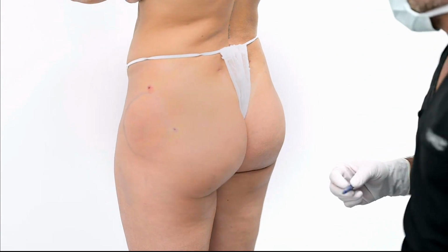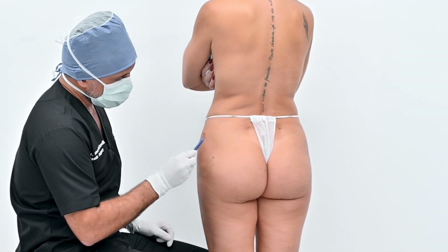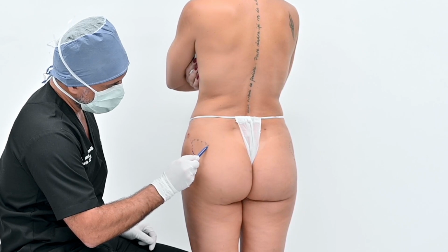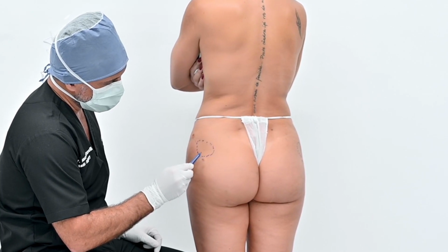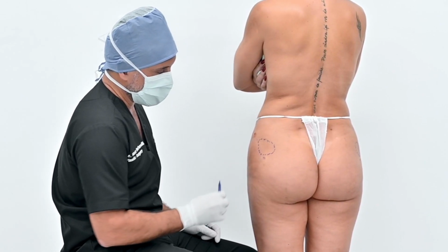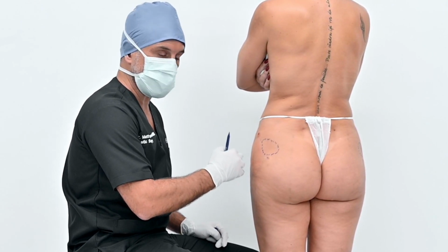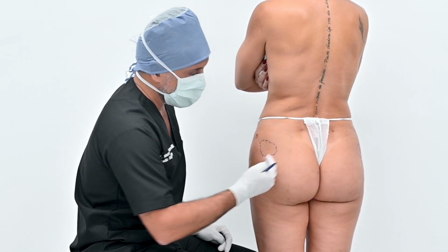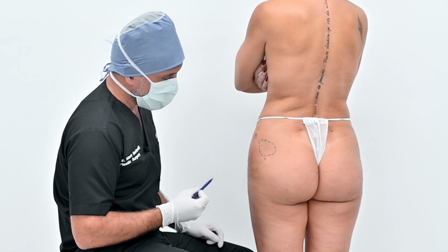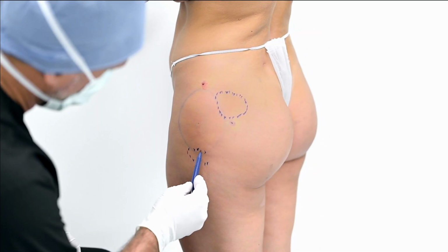Let's do the same on the other side. What do we see? Same story. We have a little depression here. Actually, it was not the treatment plan, focus on the hip dips, but as I always say, when we treat an aesthetic unit, it impacts the surrounding ones. So now it's obvious that we need to make a little complement here, and also at this level.